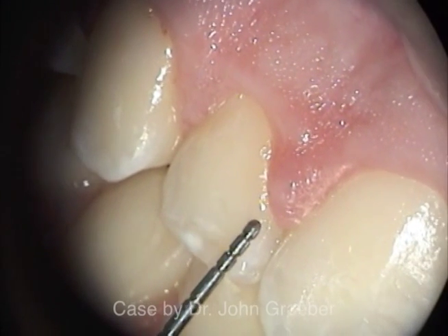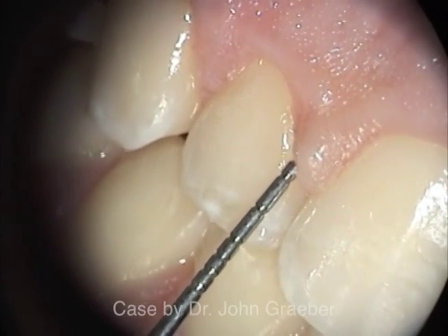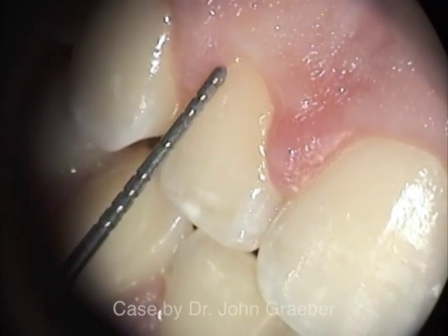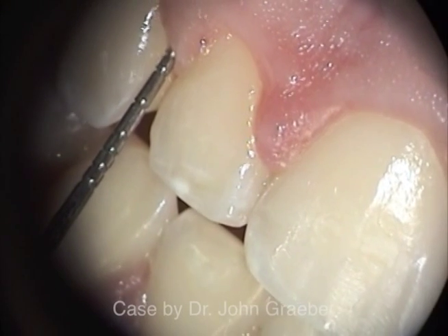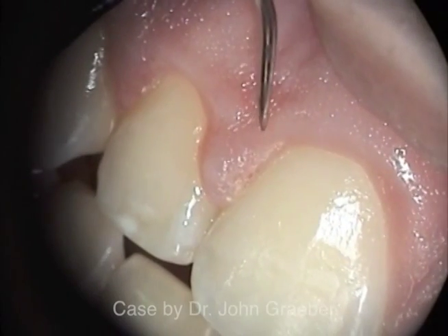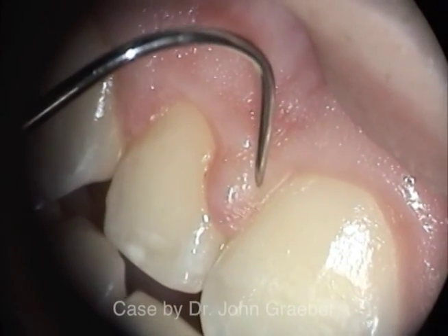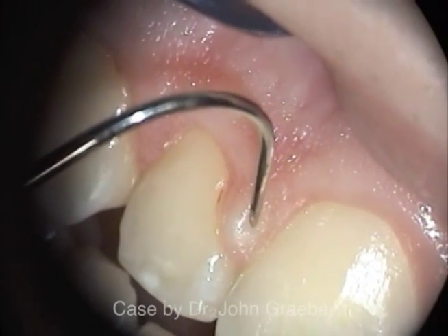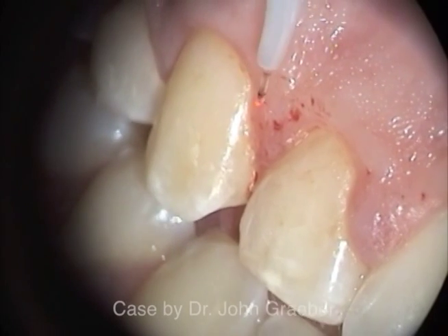Before planning the surgical removal of the excess gingival tissue, the level of the epithelial attachment is explored with the periodontal probe. Care needs to be taken not to remove any of the attachment. The tissue is checked for adequate local anesthesia, as well as marking the incision line with an explorer, creating small bleeding points.